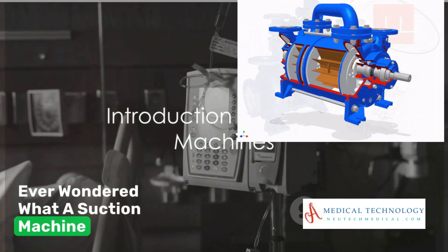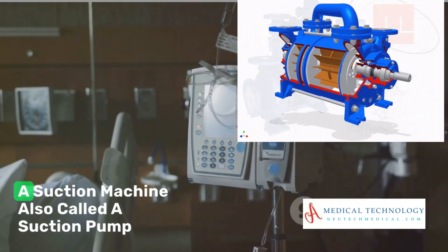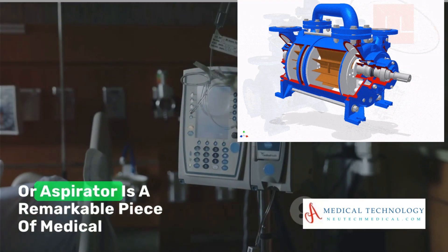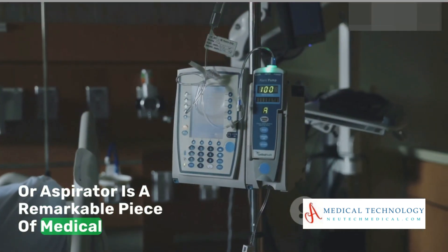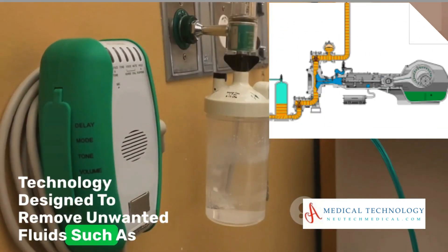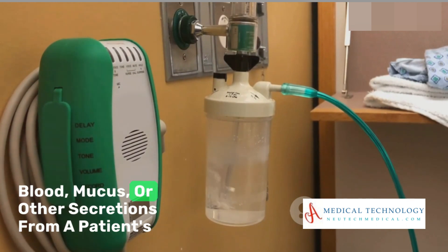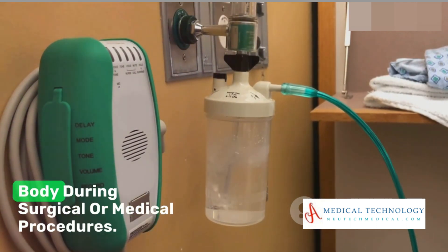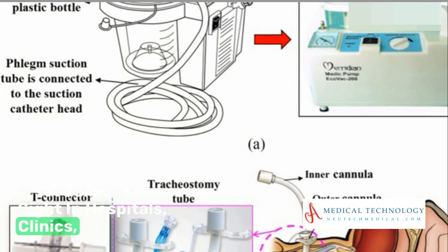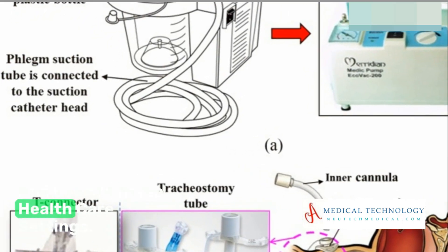Ever wondered what a suction machine is and how it functions? A suction machine, also called a suction pump or aspirator, is a remarkable piece of medical technology designed to remove unwanted fluids such as blood, mucus, or other secretions from a patient's body during surgical or medical procedures. It's a common sight in hospitals, clinics, and even in home healthcare settings.